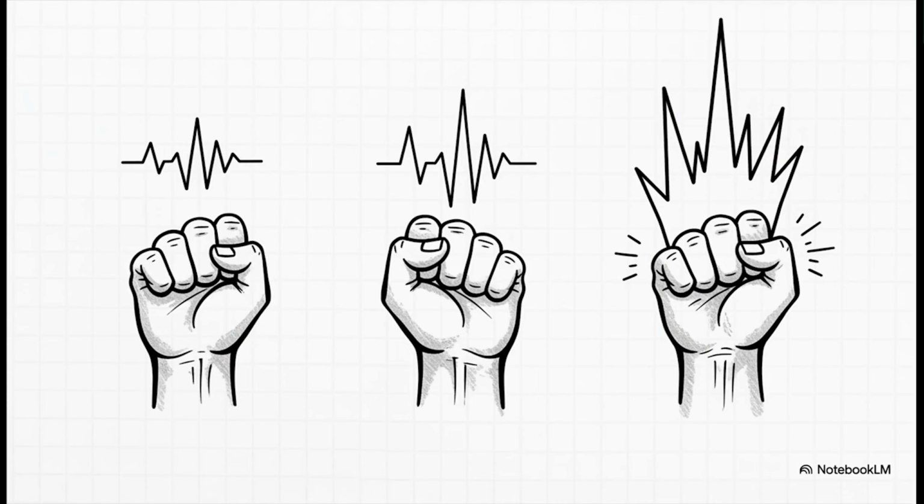It's not just about movement versus stillness, though. It's all about power. Changing your contraction intensity directly alters that visual waveform. Picture yourself making a fist. Now squeeze it harder and harder. Tools that visualize this data show how your flex intensity directly pumps up the amplitude of the visual wave. A light squeeze is just a tiny ripple, but a maximum effort squeeze, that creates a massive, towering spike. The size of the wave is a direct, visual translation of your physical effort.